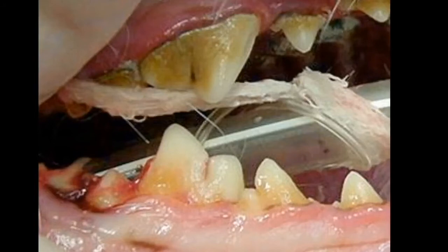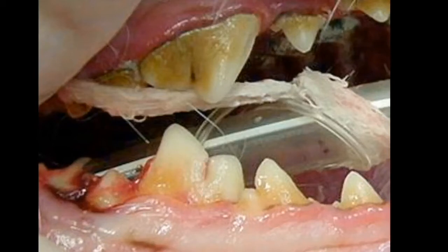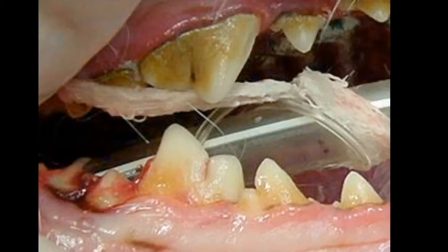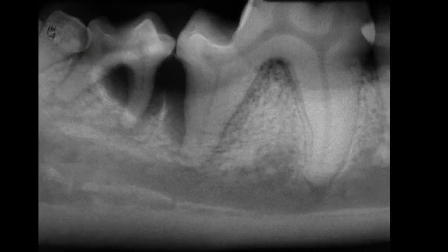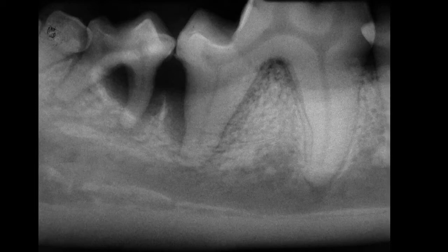This is a case in canine dentistry. This is an older case, but it's a good example of bone grafting in a very common area — back between that first molar and second molar, right in that space where we've got the capacity to accumulate plaque on those occlusal surfaces much more readily. Looking at that radiographically, you've got that defect adjacent to the distal aspect of the distal root on that first molar, which is a significant area.